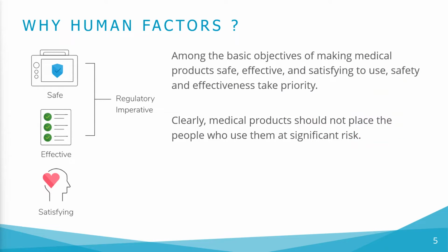Why human factors? It is the regulatory imperative. Firstly, the purpose of applying HFE is to make products that are safe, effective, and satisfying to use. Clearly, medical products should not place the people who use them at significant risk. Equally clear is the need for medical products to enable people to perform tasks correctly so that the product fulfills its intended purpose, for example, delivering treatment. Therefore, a medical product's safety and effectiveness are design mandates.